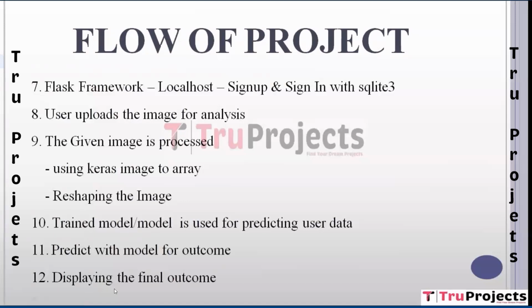And then lastly, we have displaying the final outcome, presenting the results of the breast cancer analysis to the user through the web application. This could include displaying the predicted outcome, probability scores, or any relevant diagnostic information.